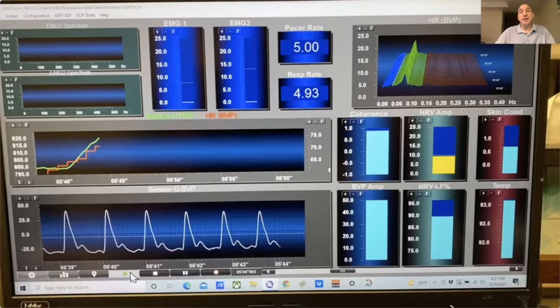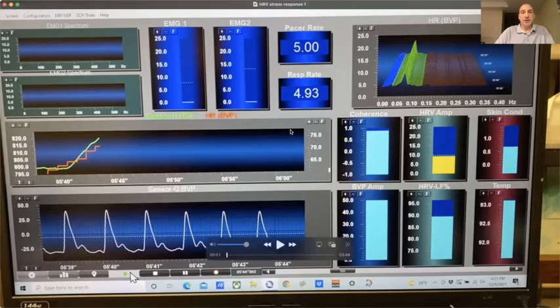And you're going to see in the HRV readings when that moment happens. You'll also notice, and I'll point out, that there is a stress response taking place just knowing that they're going to be asked to bring up a memory. So they know that it's coming, but they were asked not to go into it until I gave them the cue. And then we'll see the moment they go into the memory, how their sympathetic, parasympathetic nervous system loses the plot. So I will start the video and then talk you through a few of the metrics.